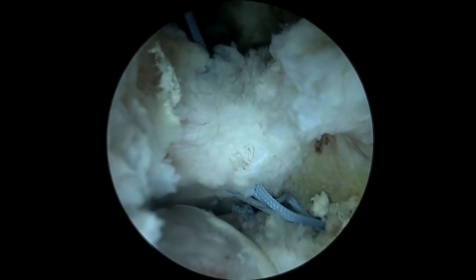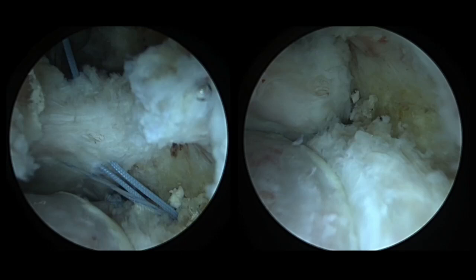The medial capsular closure is inspected to ensure adequate repair, and then the remaining traction is released from the operative extremity. These still images demonstrate before and after tying the medial capsular repair sutures.